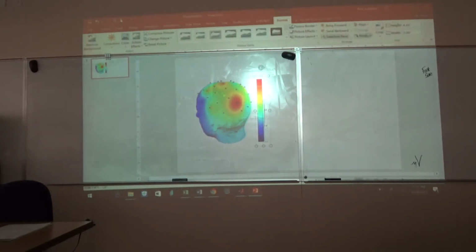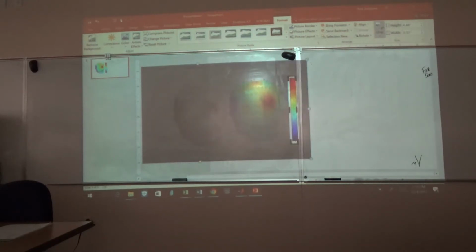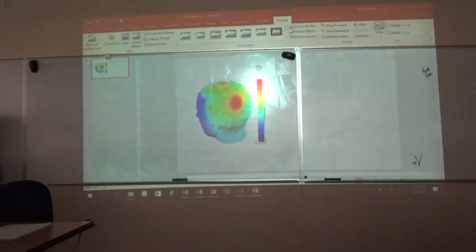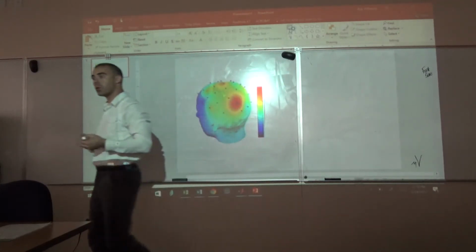So I'm going to highlight that again. I'm going to crop it. It's actually 3.7 and 1.1. I'm going to zoom that in. See how I just cut that right out? Just like that. Okay, so now we can even shrink that a little bit. And now we want to add a text box. So that's what we have up here. Just hit this little text box. We're just going to type in our little numbers.